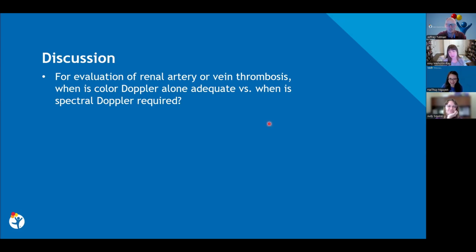I've never been asked to do that, but I guess you could just put power Doppler over the kidney and make sure that it's perfusing. I guess the question is really just yes or no perfusion, right? Because if it's pyelo, it could be hyper or maybe a little hypo, but it should still have some perfusion. Yeah, I think that's a good use for the microvascular imaging techniques, like B-Flow and SMI or whatever your vendor of choice is using. I think that can show you parenchymal hypoperfusion, if you will, even though it's not a perfusion study.